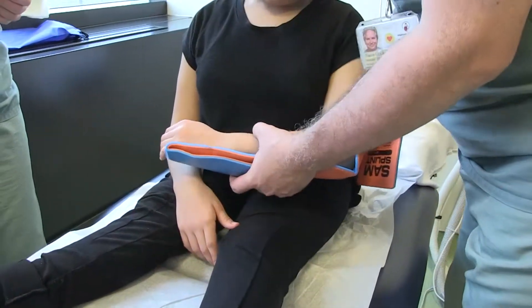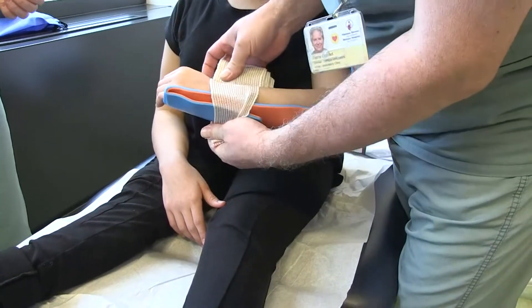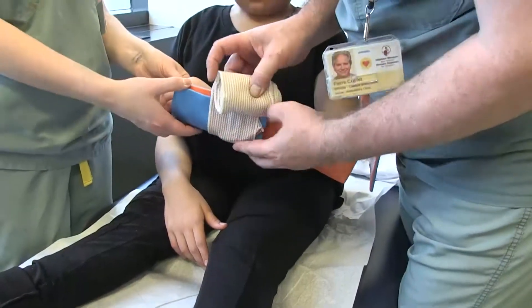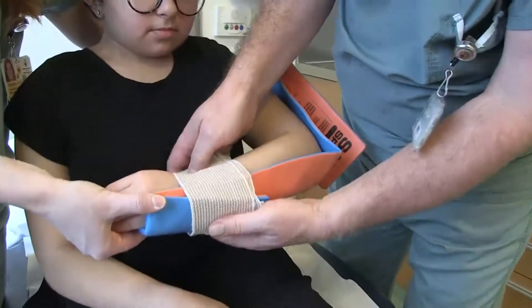And we will use an elastic bandage. You must not turn it inwards. So at the same time, as you could see, I could mold it directly on the arm.